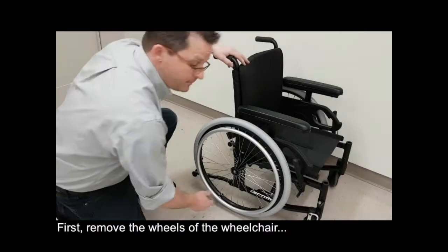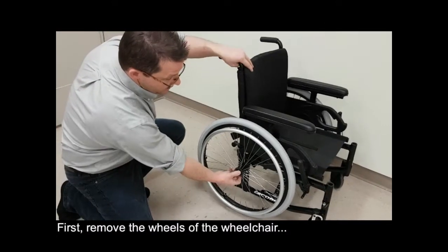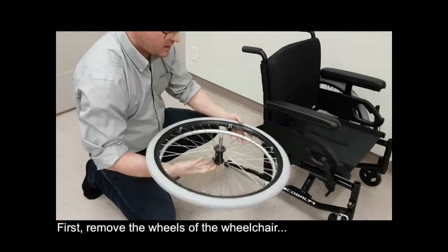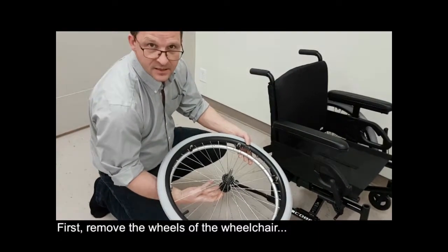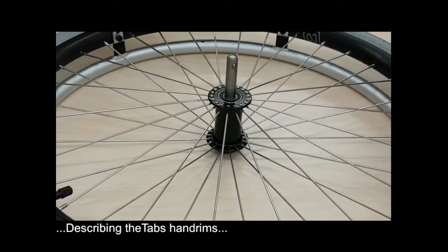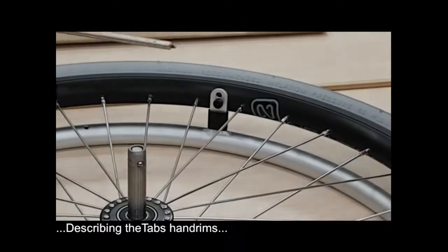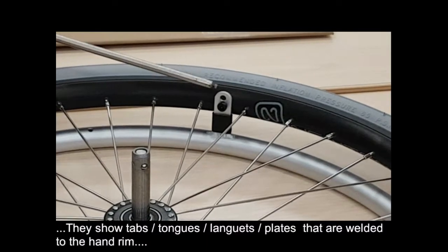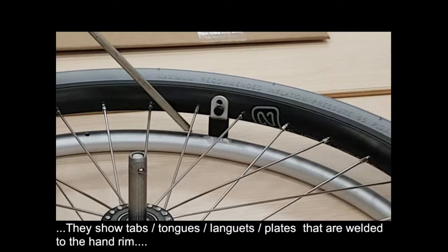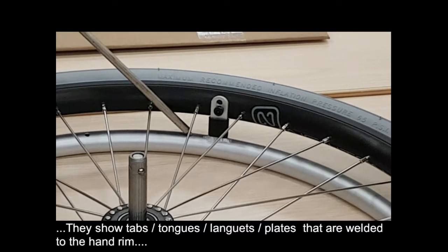Okay, so the first step is to install the blocking disc on the wheelchair. First thing, we take a wheel and we're going to install the blocking disc. What is a tab on Handrims? They show tabs, tongs, languettes, or plates that are welded to the Handrim.